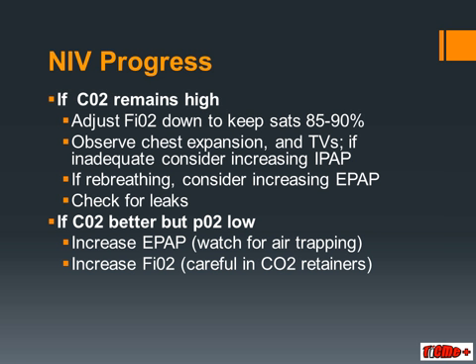You should increase the FiO2 if absolutely necessary, but remember that in chronic CO2 retainers who have an element of hypoxic respiratory drive, you may encounter a reduction in minute volume after the FiO2 goes up. Remember also that increasing FiO2 will make the SATs look better, but won't augment or improve respiratory physiology.